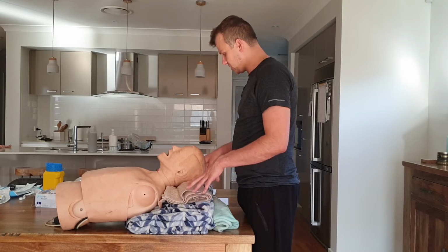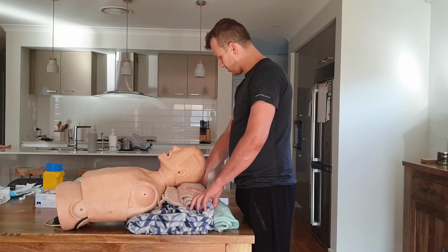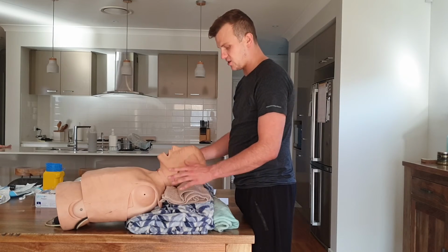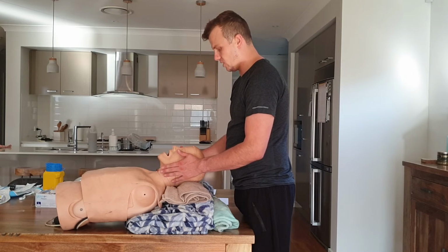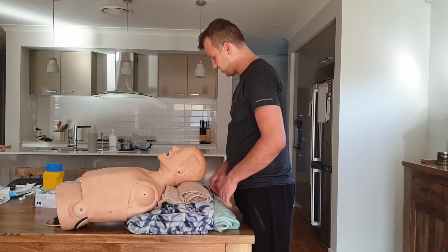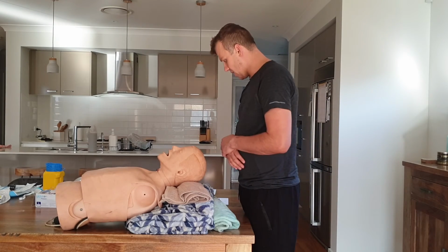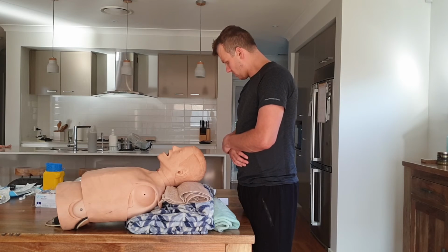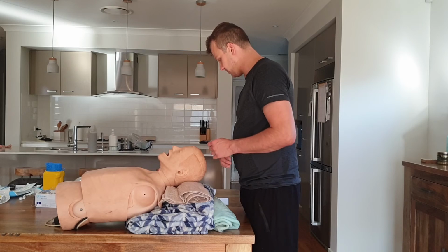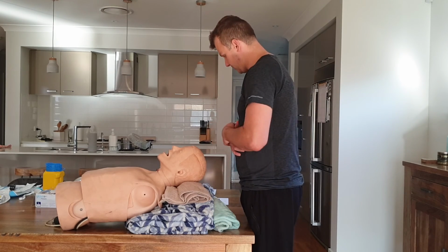Avoid the sniffing position when the patient has a suspected C-spine injury. The laryngoscopy can be performed using manual inline stabilization of the head. So with all of these blankets, you have manual inline stabilization with someone assisting you. Avoid neck mobility assessment again if there's any C-spine injury. And then, if you assess the patient as upright as possible, it will increase the functional residual capacity and decrease rate of breathing and oxygen consumption.